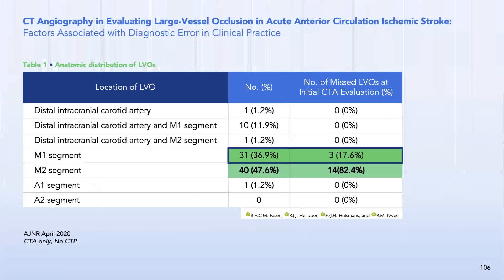Rotating the CTA, the near-occlusive clot in the posterior M2 division becomes visible. At angiography, a near-total occlusion is confirmed with a thin rim of contrast distally. After just one pass with an aspiration catheter, a TICI 3 result was achieved. The patient's aphasia and facial droop resolved; 24-hour follow-up was excellent.